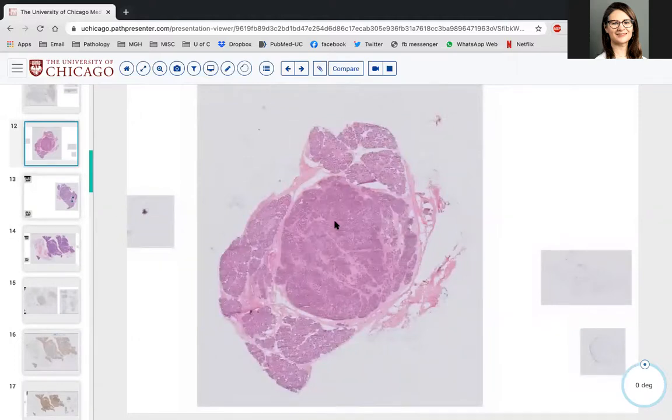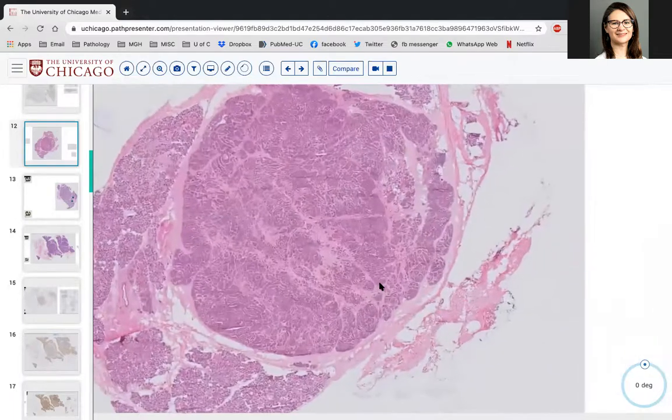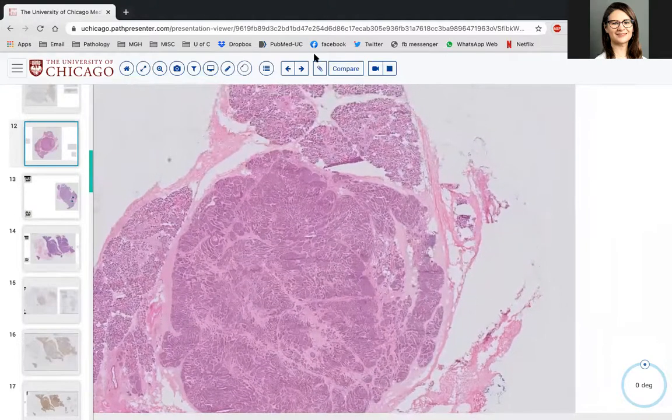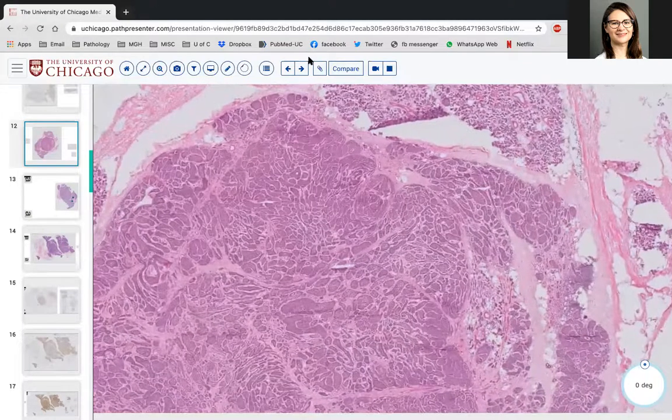So moving on to the next case. I don't have a core biopsy here. This was a 64-year-old male with asymmetry of the submandibular gland. And what it was called on FNA, there was no core, was a basaloid salivary gland neoplasm. So again, when basaloid cellular salivary gland neoplasms are seen on FNA, what does that generally imply for the histologic differential?